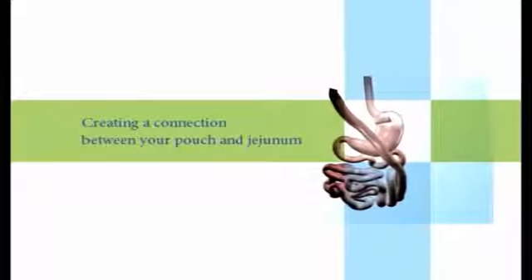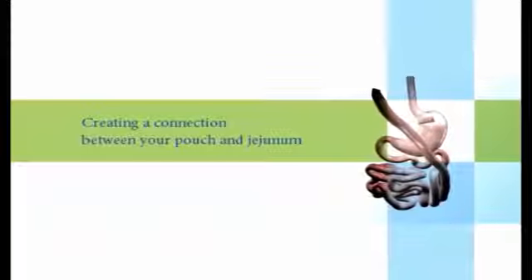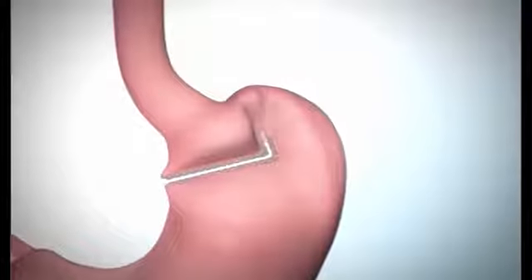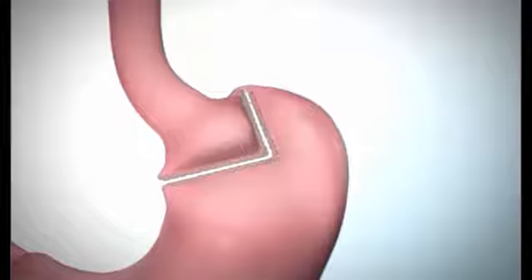Your surgeon starts by using an endoscopic stapler and divides your current stomach about one to two inches below the area where your esophagus connects to your stomach.